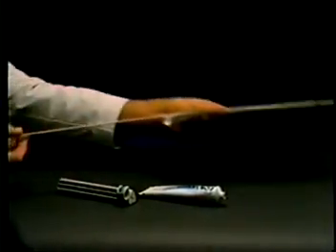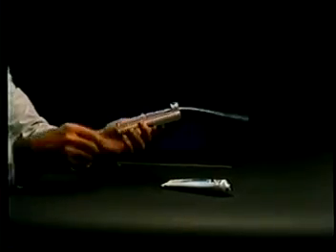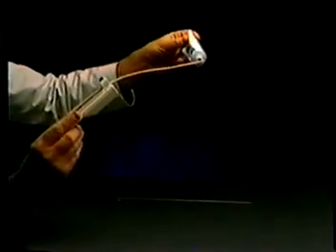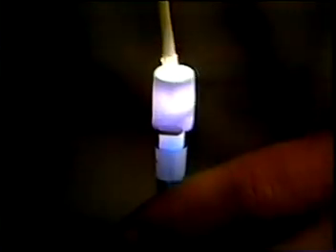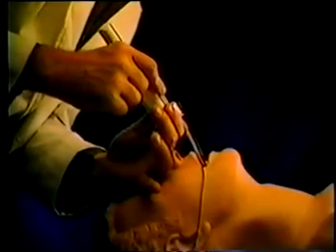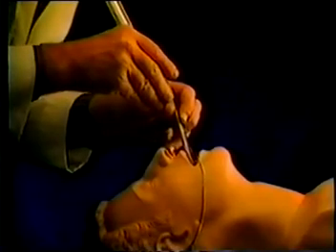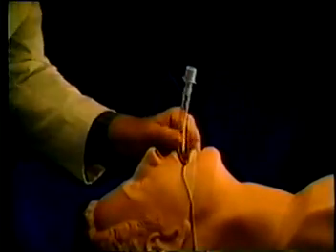To check the position of an in-place endotracheal tube, remove the stylet entirely, making the wand completely flexible. Attach the wand to the handle but do not advance it towards the clamp. Lubricate the tip of the wand and, with the tracheal light turned on, slide the wand into the in-place tube until the 15 millimeter fitting is seated firmly. Flip the locking lever, then squeeze the release arm, and watch for the glow moving down the trachea as you advance the connector until the centimeter markings on the wand line up with those on the tube. If the glow is not visible at or near the sternal notch, the cuff should be deflated. The tube can now be safely pulled back. When the glow appears just above the sternum, anchor the tube, remove the TrachLite, reinflate the cuff, and proceed with standard ventilation practices.